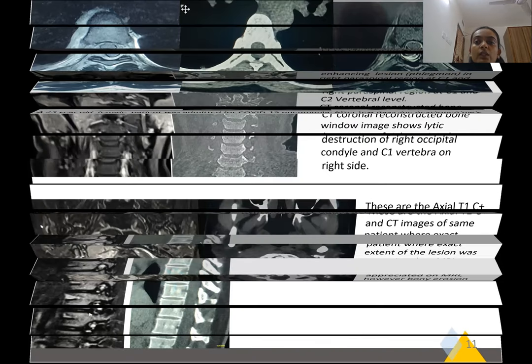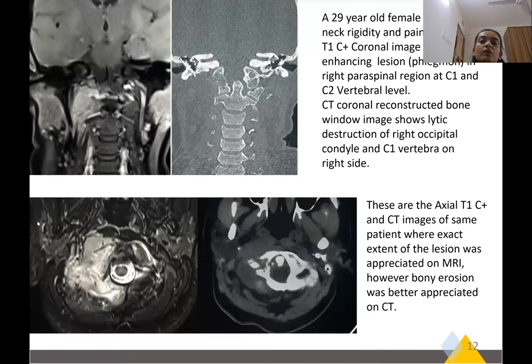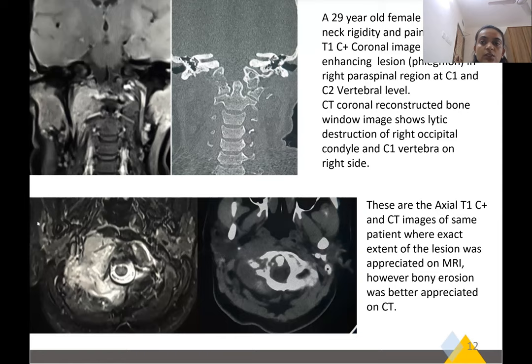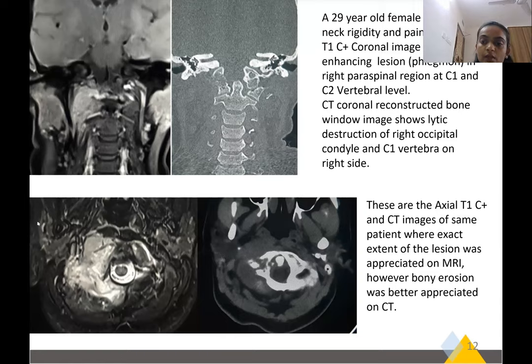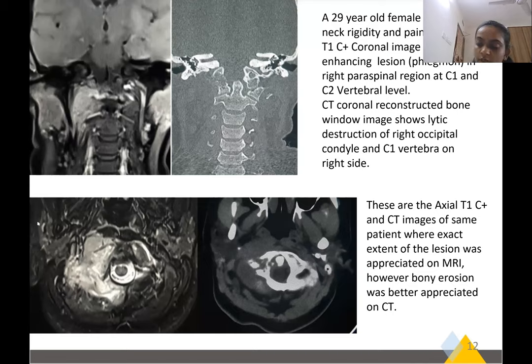Another 29-year-old female patient presented with complaints of neck rigidity and pain. On contrast coronal images, a collection is seen in the right paraspinal region. CT coronal reconstructed bone window image at C1 and C2 vertebral level shows lytic destruction of the right occipital condyle and C1 vertebra on the right side. On axial images, the exact extent of the lesion is better appreciated on MRI; however, bone erosion was better appreciated on CT.